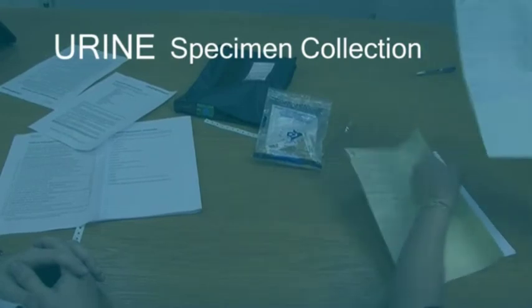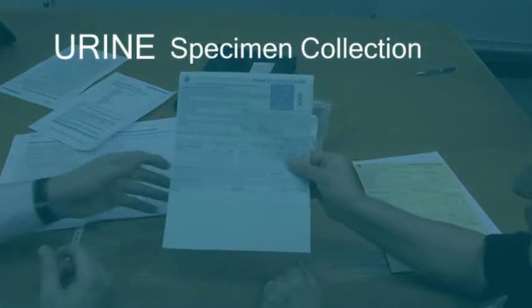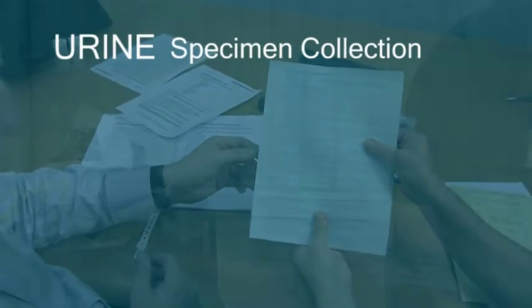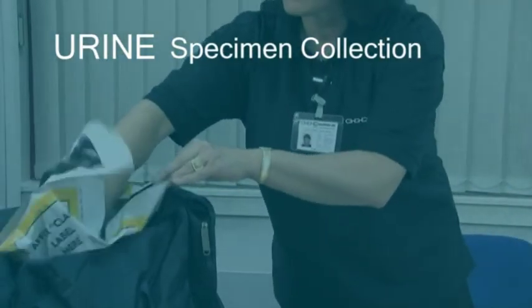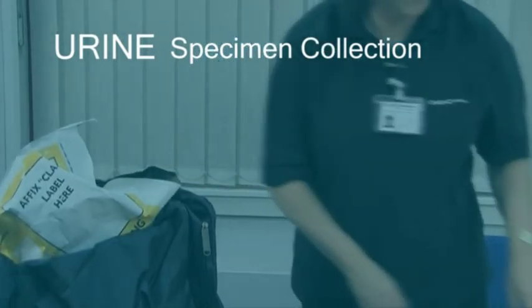Hand the donor their copy of the chain of custody form. The donor may now leave. Place the sealed chain of custody bag with your other collected specimens in your kit bag and prepare your paperwork for the next donor.